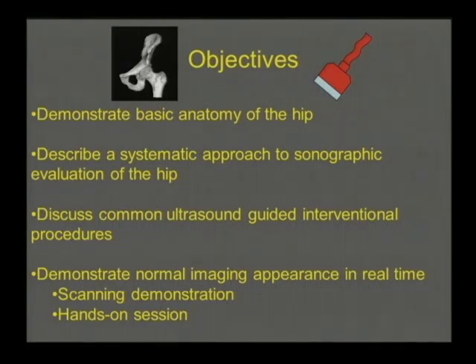a number of ways. Being a radiologist, I've certainly spent a lot of time looking at radiographs, CT, MR, in addition to ultrasound. So I'm going to use a combination of all those modalities to show the important structures in the hip joint itself, and then some of the surrounding muscle as well. And taking all those together, we can really get a good appreciation of what these are. Get a sense of what we're looking at.